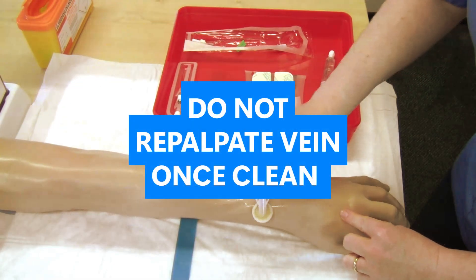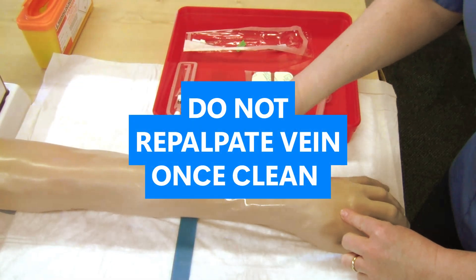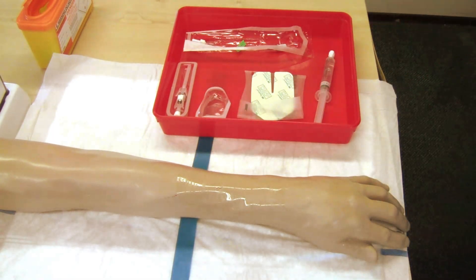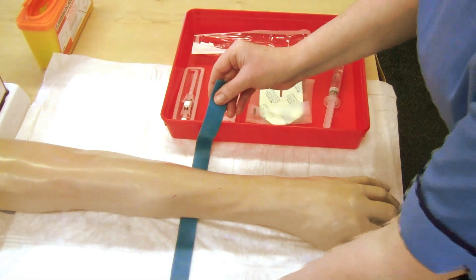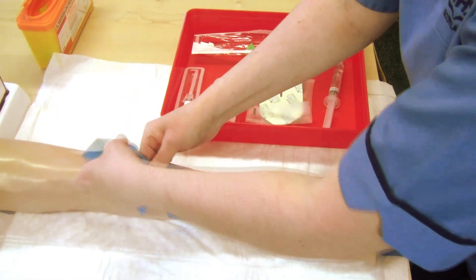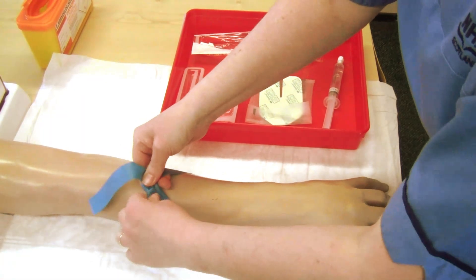Do not repalpate the vein once clean. Apply tourniquet for no longer than 2 minutes, making sure not to contaminate the skin you have just cleaned.